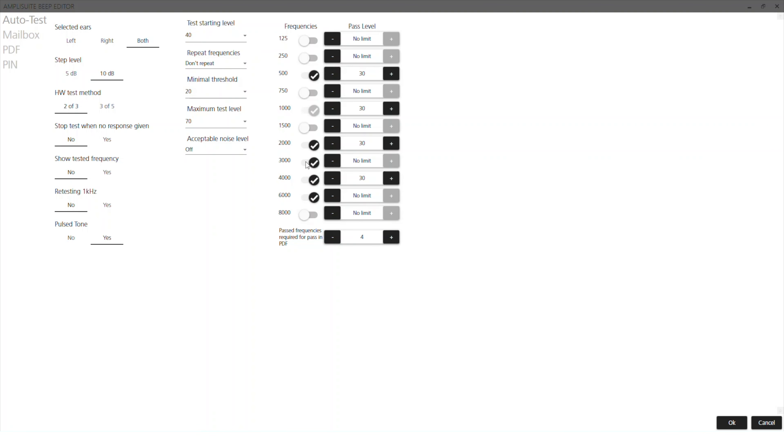The beep editor software allows you to choose which frequencies you want to test and also the intensity range that you want to test within.